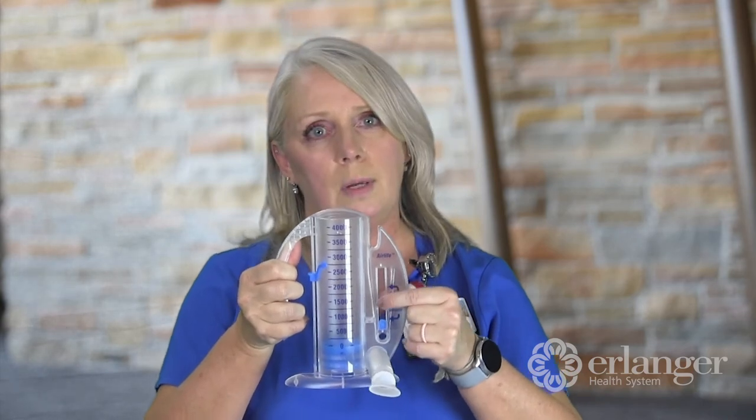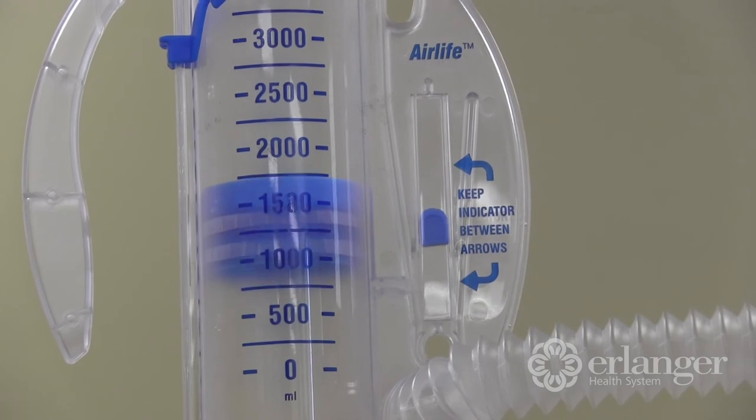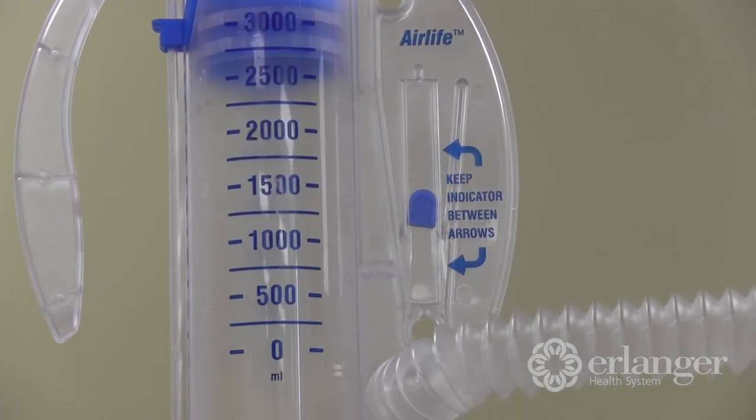As that hovers, the little diaphragm is going to raise up, and we are going to set goals for you to use this.